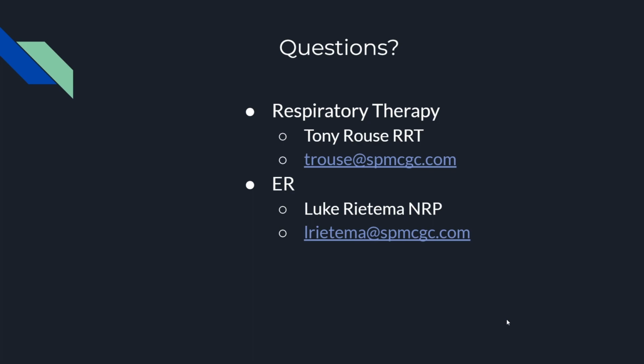If you have any questions at all with the vents, please don't hesitate to reach out. Tony in respiratory is, of course, the actual expert on all of this. I'm just helping him out by making this quick little video about how to actually operate the vents, because I'm familiar with actually operating the vents. But if you have questions about the disease processes and actual respiratory treatment, Tony's your expert. There's his email. There's also my email if you have any questions at all for me. I'll be in the ER, of course.